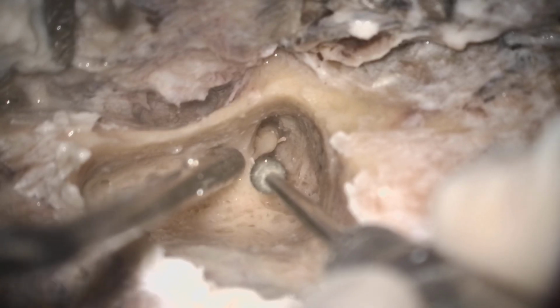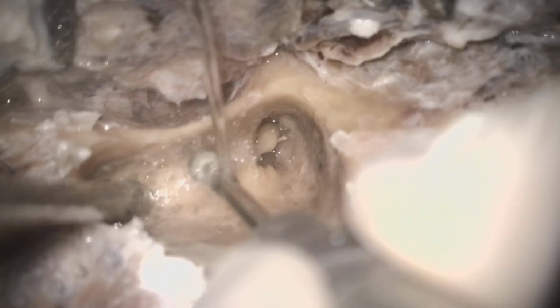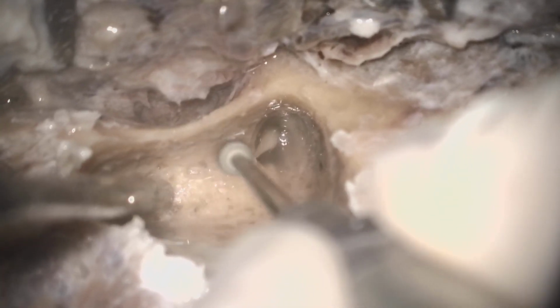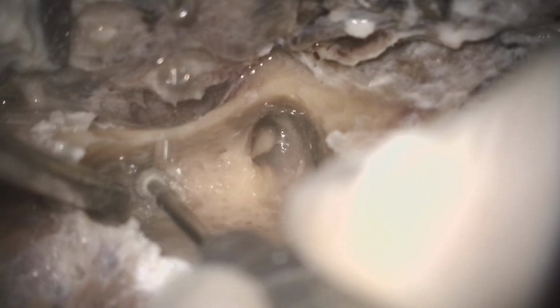Now there are some cells that you will find while doing this posterior tympanotomy, and sometimes these cells are very helpful because this is the natural tract that goes from the mastoid to the middle ear, and that actually presents into the very cellular mastoid, and that is guiding you to reach the mastoid cavity.